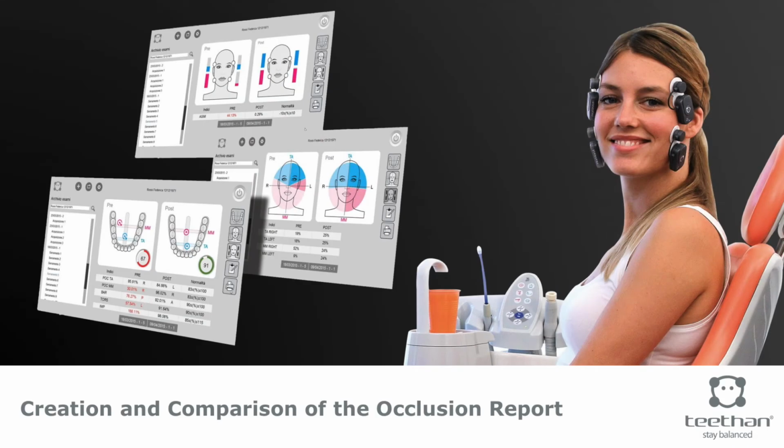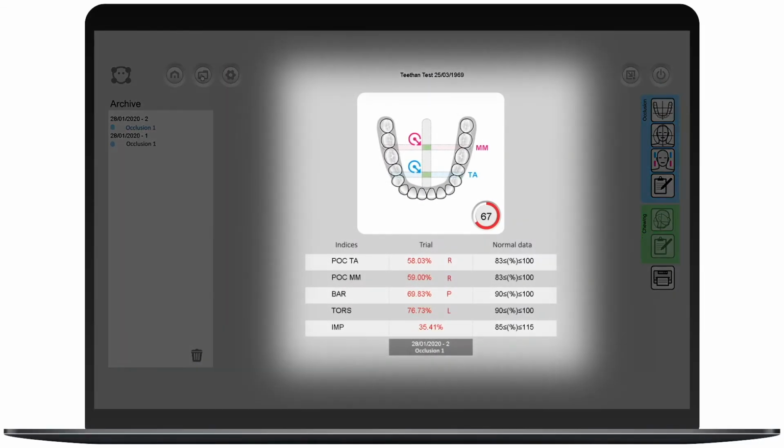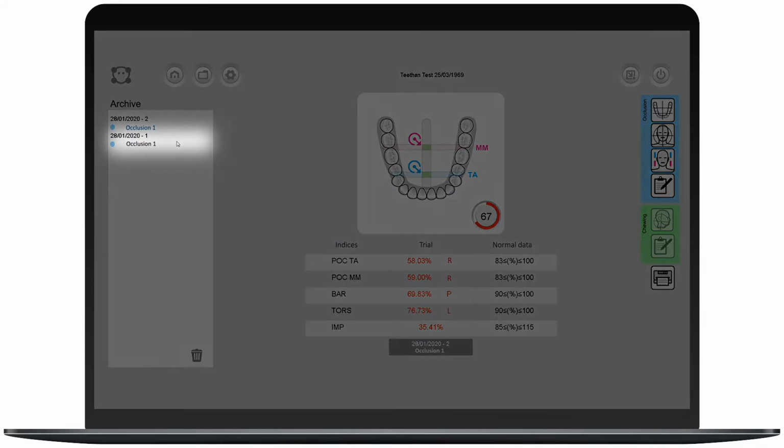Creation and comparison of the occlusion report. After completing the occlusion test, a report is automatically generated. Click Save and it will be stored into the patient database. If you recorded more than one test, it is possible to compare the different results. Based on the time of recording, the label pre and post will be assigned to the tests.